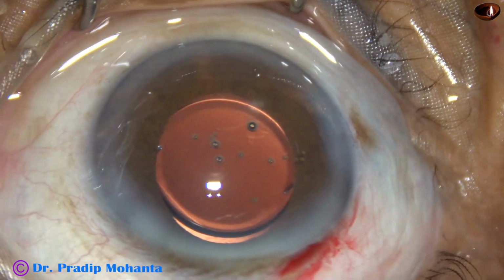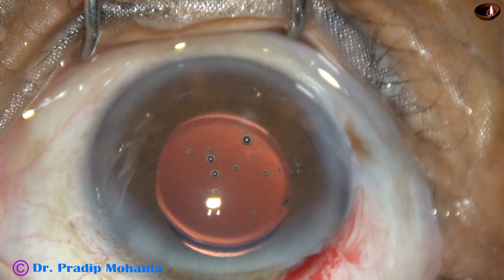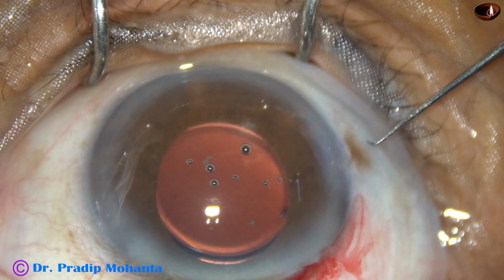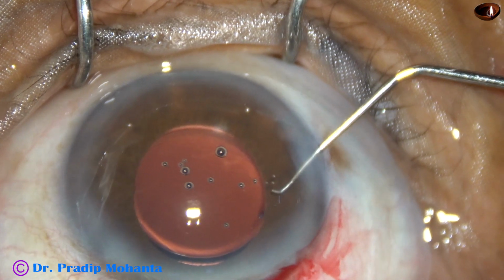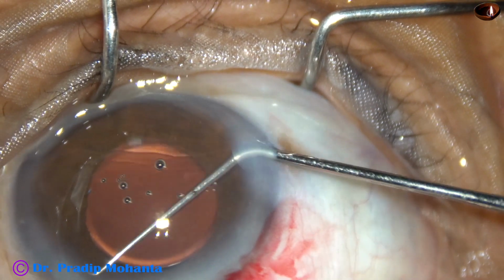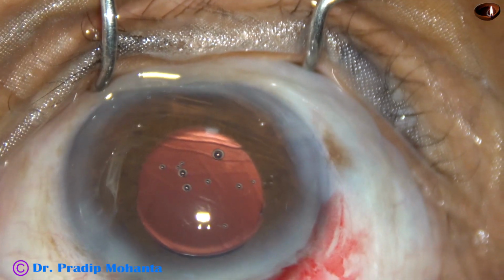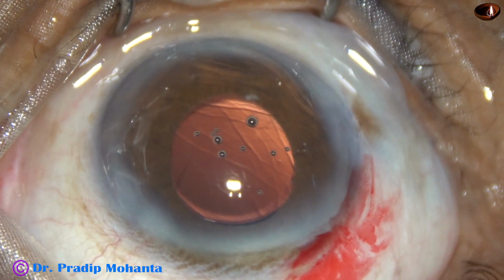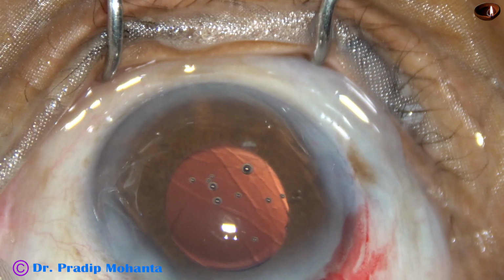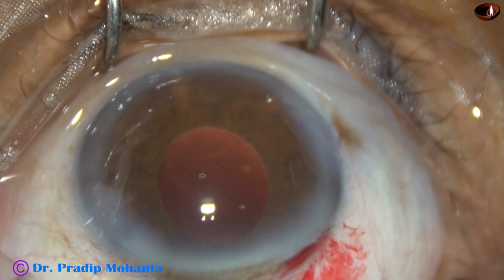Now this is pilocarpine. I have not used triamcinolone acetate. In this case, I have faced some raised IOP with triamcinolone acetate, so in this case, I have not used it. I am taking help of pilocarpine and this Sinskey hook. I am trying to hook any strand if it is there. You can see there is no peaking of the pupillary margin. Pupil is round, so there is no vitreous in the anterior chamber.